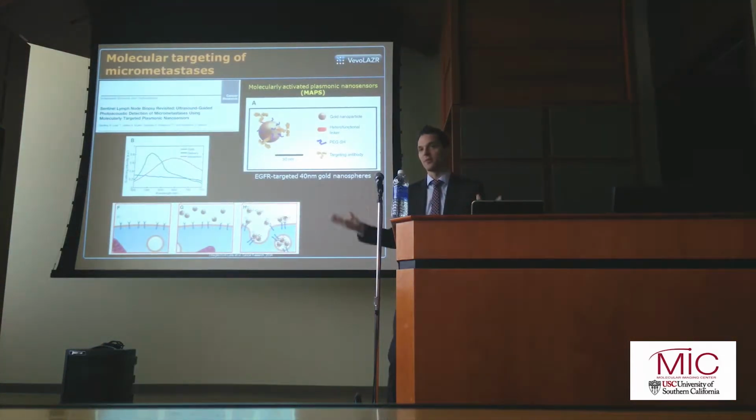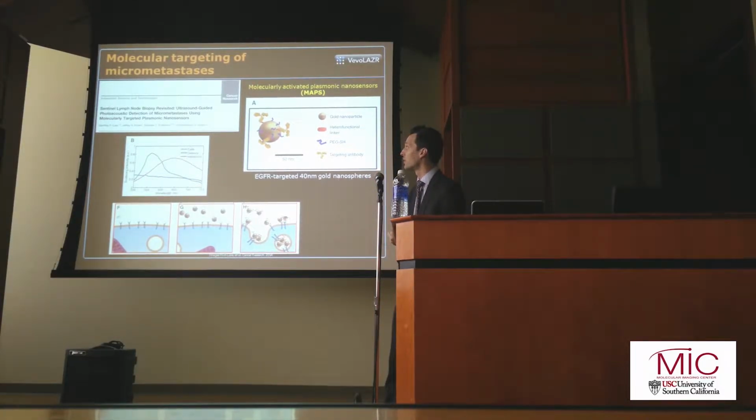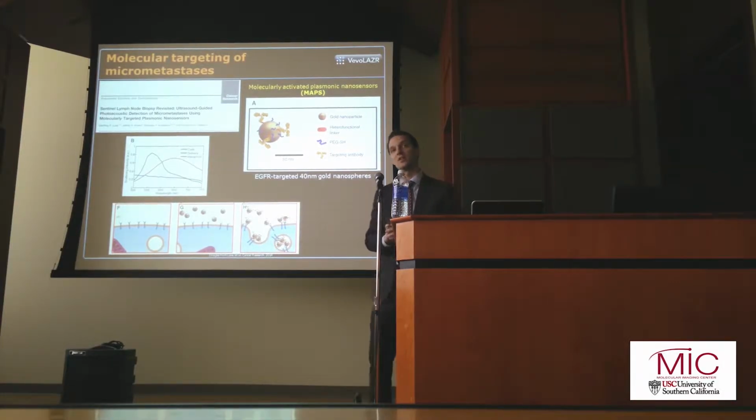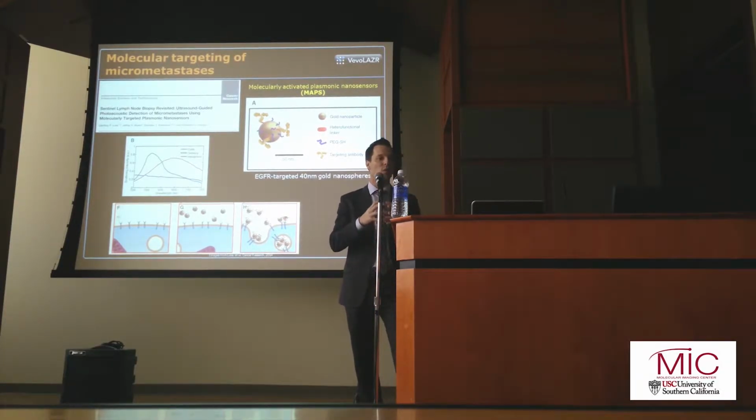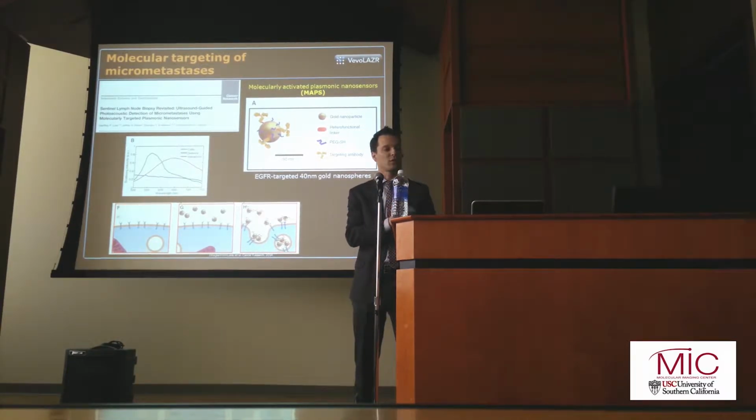Now, of course, everyone wants to do targeted molecular imaging, and there are several examples, but I want to focus on one. This was published in Cancer Research quite recently. It's from Stanislav Emelianov's group at UT Austin. They've been working on this for a while, but they're developing a contrast agent based on gold. So they've got this gold particle, which absorbs very nicely in the near-infrared range, so it's good for using with photoacoustics. They have this gold particle, and they can either have a targeted particle or a non-targeted particle.